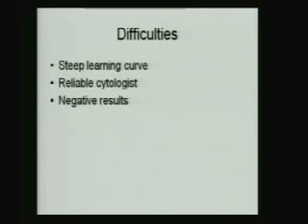What are the difficulties? It's a very steep learning curve and quite a humbling experience for advanced bronchoscopists. At the beginning, you need a reliable cytologist, preferably rapid on-site evaluation. And the last difficulty is how to deal with false negative results.